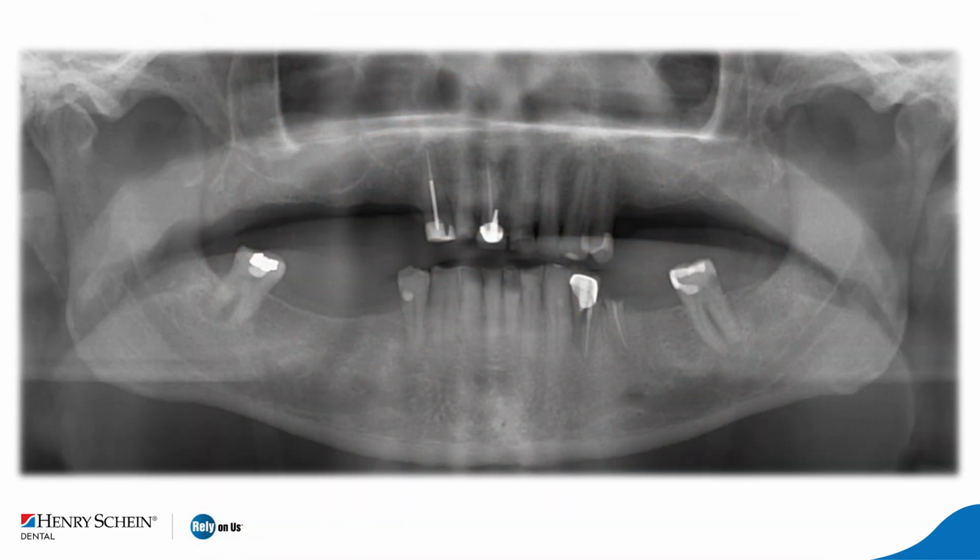So that was his panoramic radiograph. You can appreciate the edentulous area. I'm letting you look at that panoramic radiograph as well, because I like to make the webinar as interactive as we can, even though this one is pre-recorded. But when I give this to a real audience, I ask them questions.